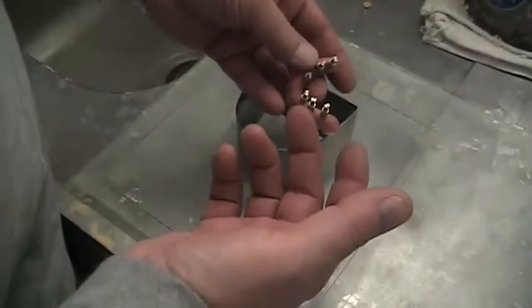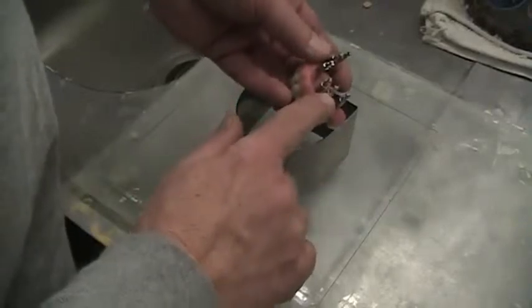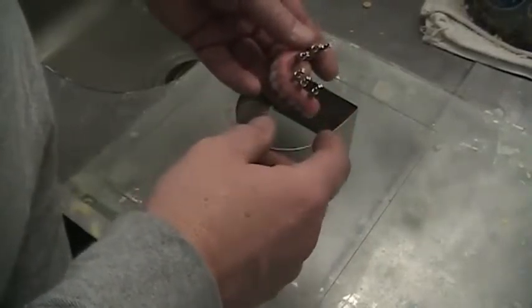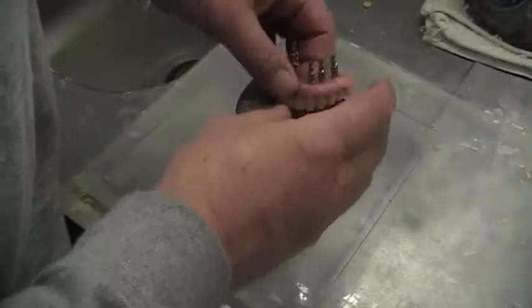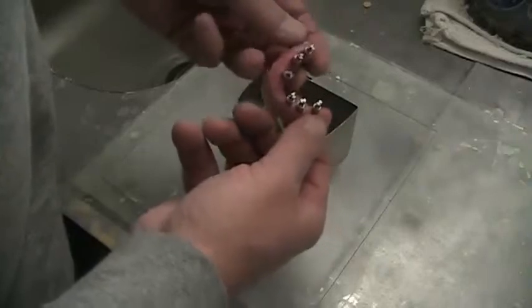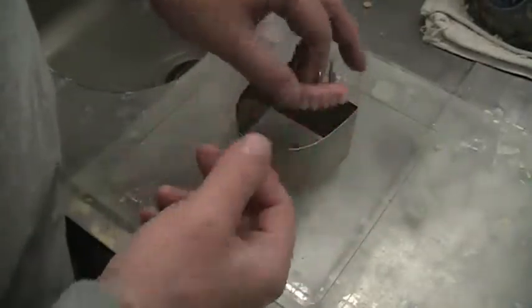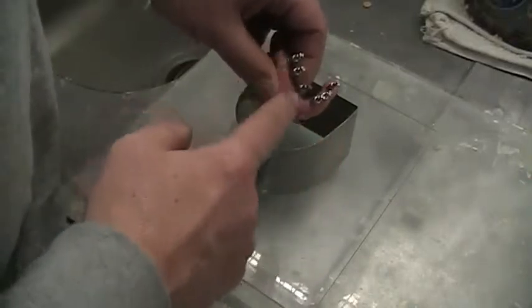But anyways, this is all polished and in wax, and now how do we preserve that? In the past I would cover this with putty, and then I would leave the mechanical retention on the backside of the analogs to engage into a pour of stone. While I was using Wonderfill one day, I thought, why don't I just submerge the implant bar into the Wonderfill and leave exposed only the area that's smooth wax and implant analogs, and then pour my base upside down. So in other words, I have everything else covered, so all I have to be concerned about is replicating all of this in stone.